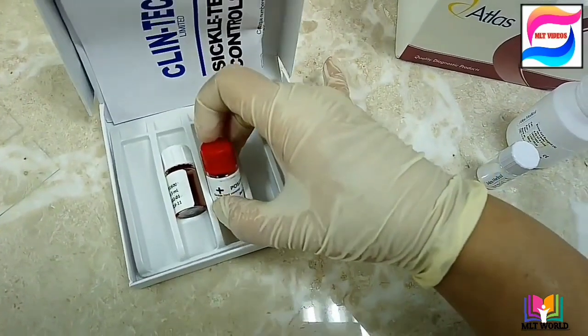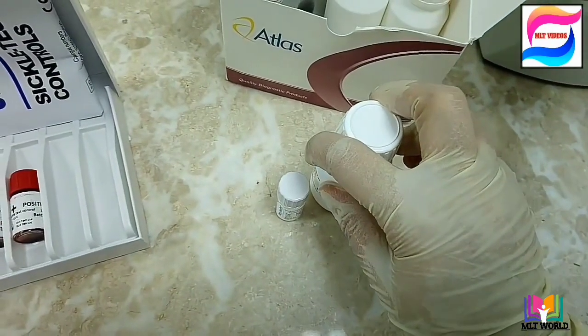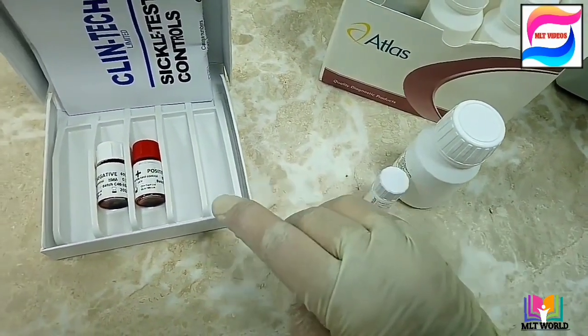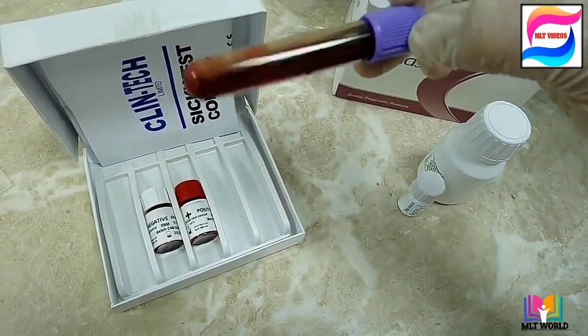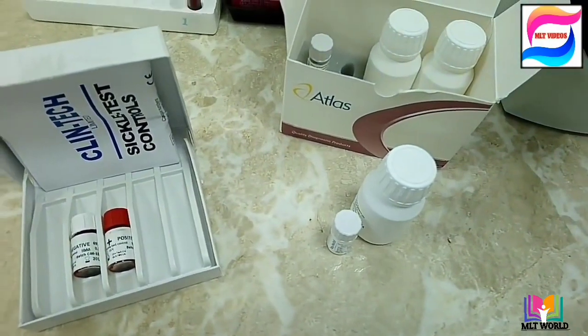Once we prepare the working reagent, it can be used for 15 days. After 15 days, you must discard the reagent. For this test we need the patient's EDTA whole blood, because sickle cells are present in red blood cells, which are present in whole blood.